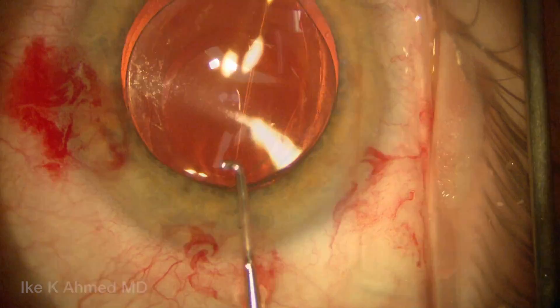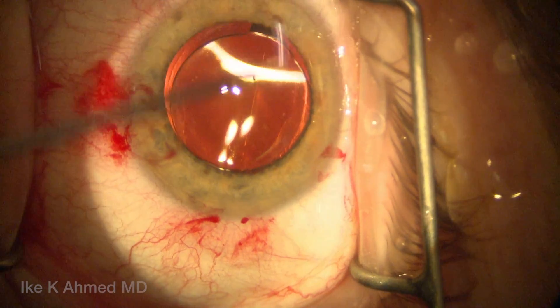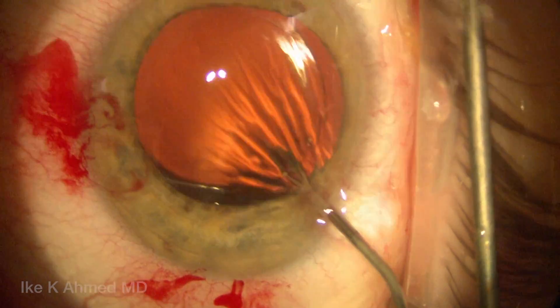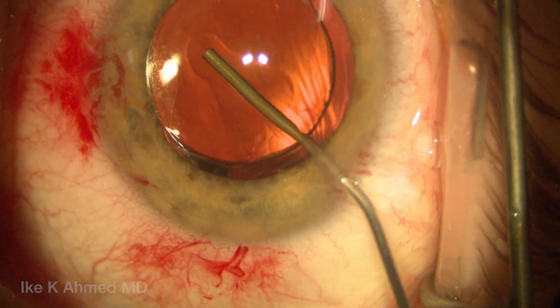This is now basically in a reverse optic capture position. We're not going to leave it like this because the nasal area is still exposed, with the haptic-optic junction still anterior to the anterior capsule. So this necessitates us to rotate the lens.